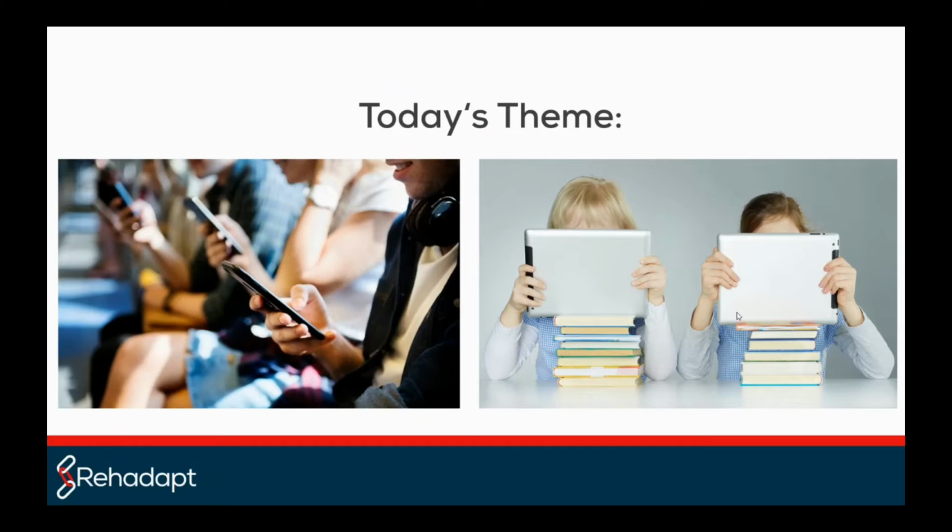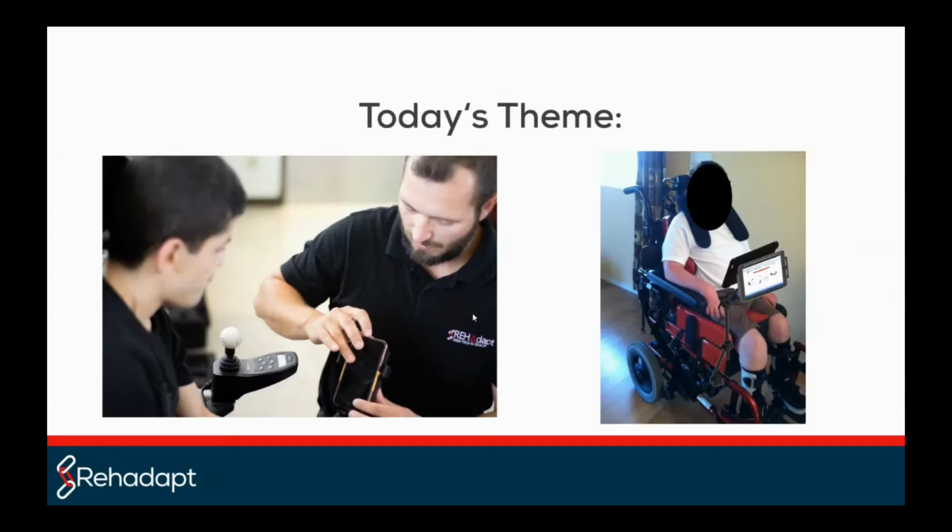There is a great importance of using these kind of tablet systems in a spot where they can use it good enough. So it's not only just that we need to give a customer, for example, with cerebral palsy, a tablet system and let him communicate with his system or let him access these systems. When you know people with cerebral palsy, you know that a lot of people have problems with controlling their movements. They have a lot of uncontrolled power. And when they want to use the tablet, grab it and hold it, it's often impossible for them.